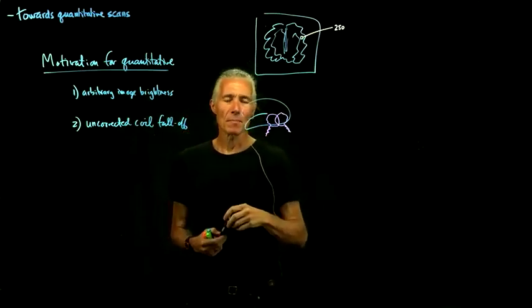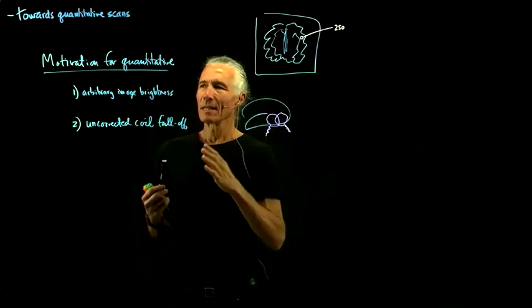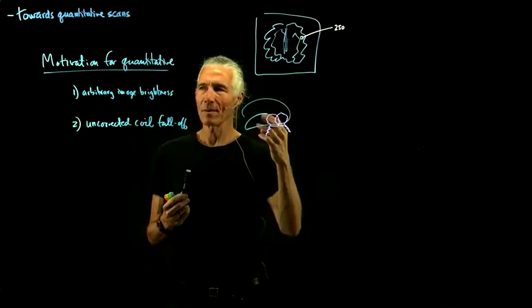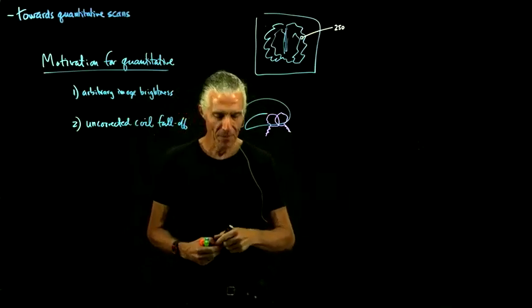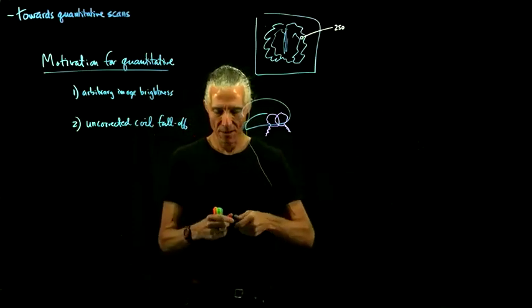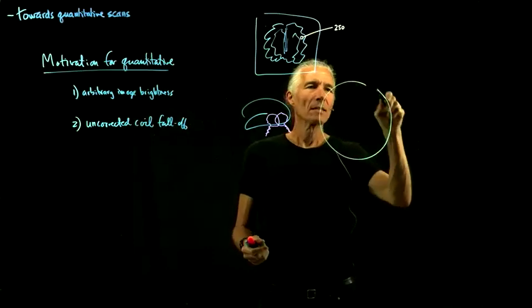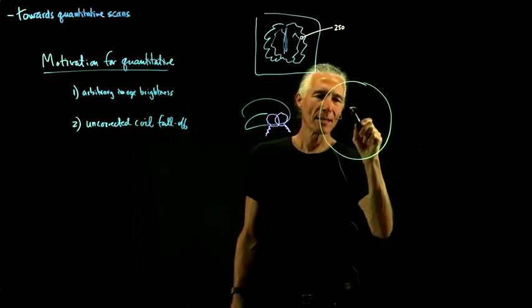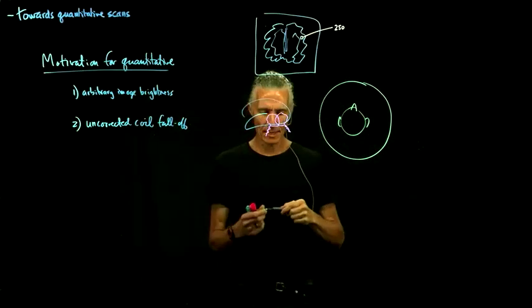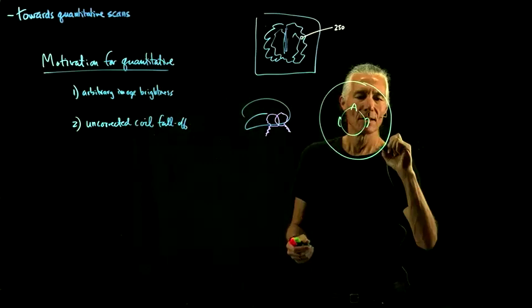But there's another feature of these coils, and that is they're quite sensitive to exactly where the brain is relative to the coil, partly because of this fall off. And so what will that do? If you put somebody in the magnet, here's a cross section of somebody in the magnet, say a relatively small person centered in the magnet, and here you have the coils.